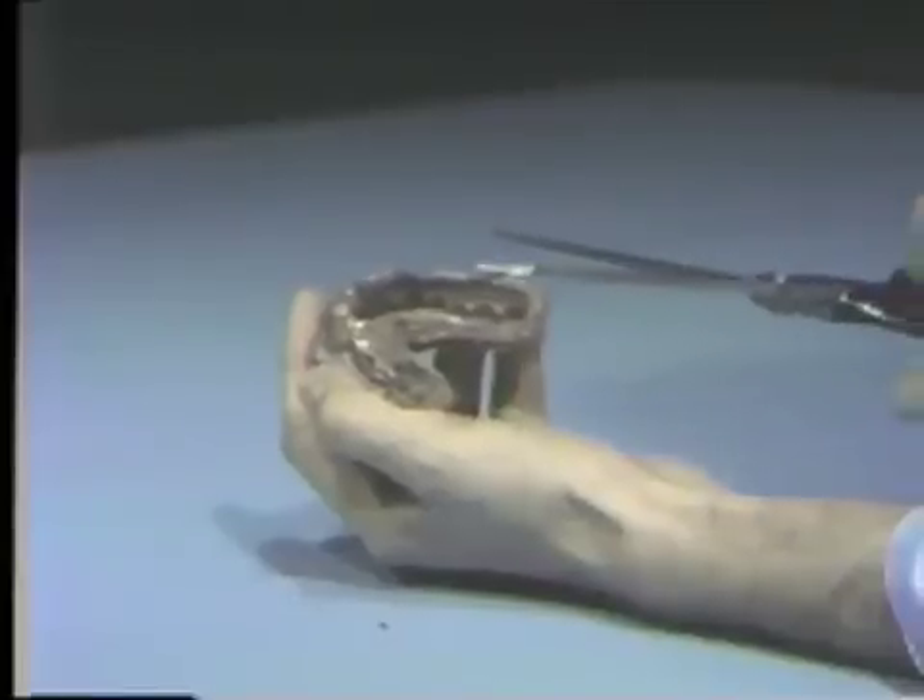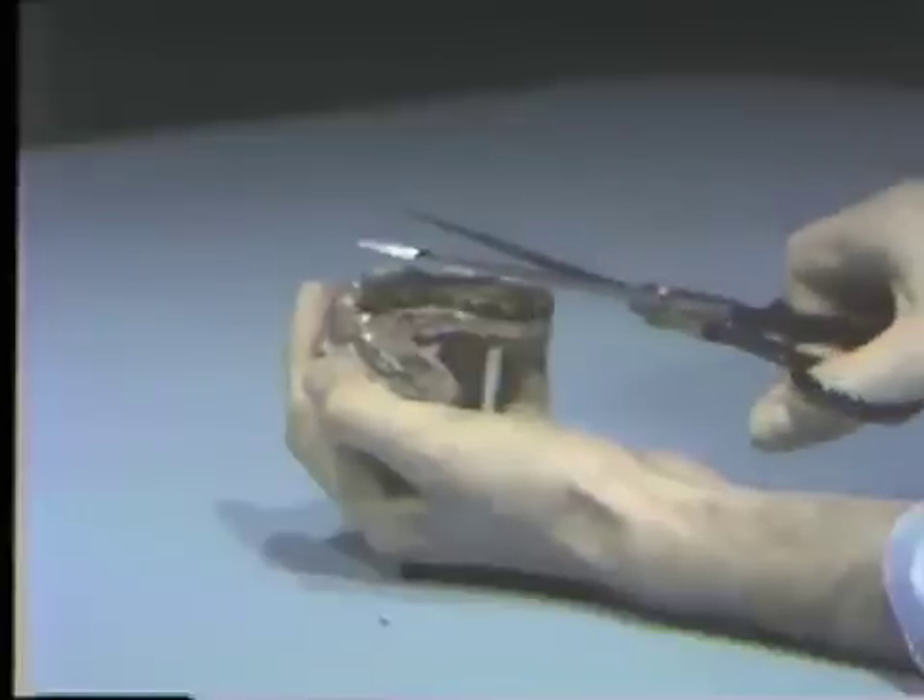Any excess rubber at the periphery of the tray can now be cut away with the scissors.